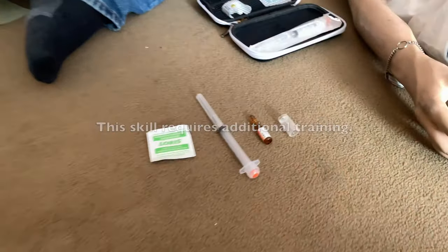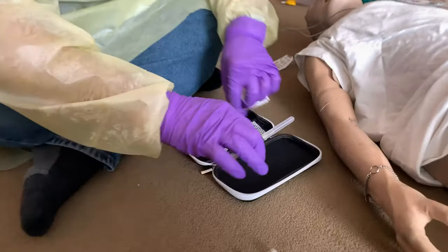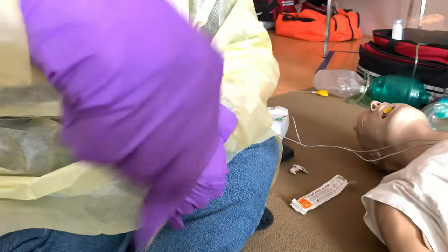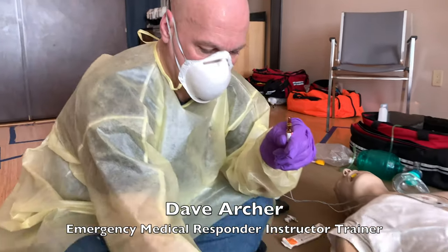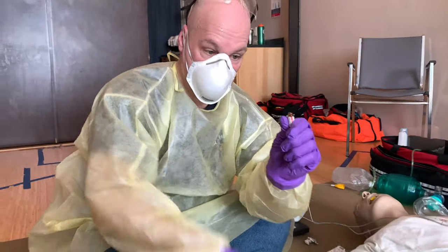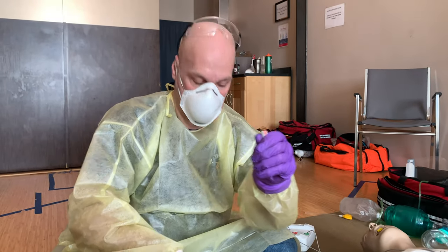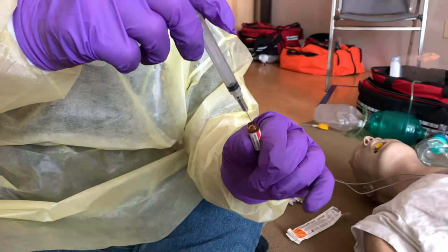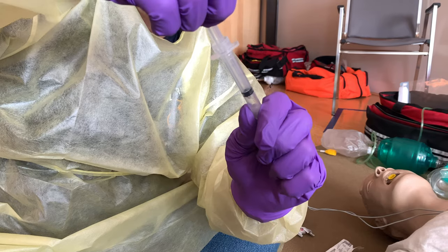To use injectable naloxone, get your syringe out of the package and ready for use. Get your vial of naloxone and spin it around a little — sometimes people tap it to get the fluid out from the cap. Use the cap breaker to safely snap the cap off. Then take out the syringe, carefully insert it into the vial, and pull back on the plunger to extract all the naloxone out of the vial.